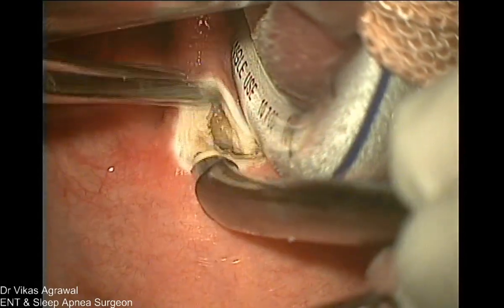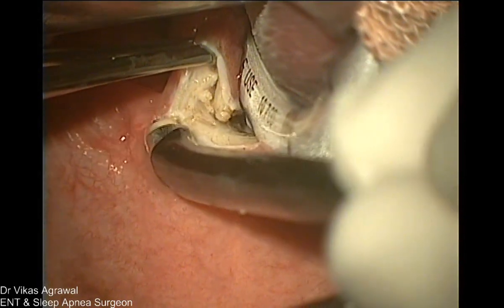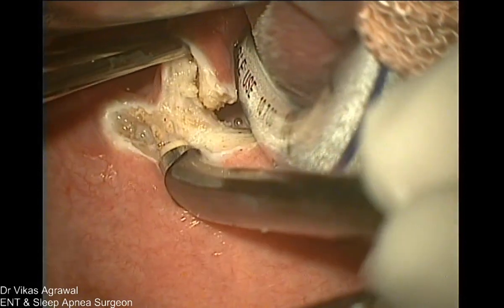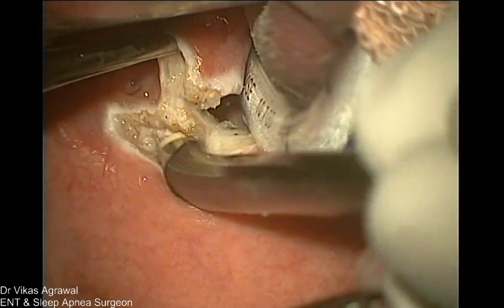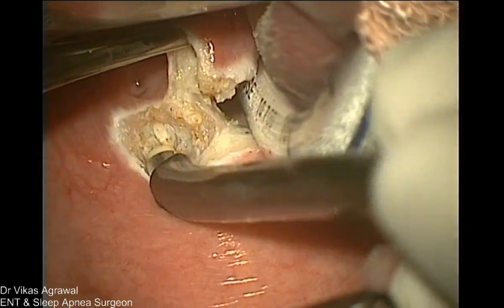Okay. So now this is the uvula and we come into the anterior pillar of the tonsil. Now there is no business removing the anterior pillar. So I'll just open up the anterior pillar to go into the supratonsillar pad of fat. Now can you see these are the fibers of the anterior pillar which we need not go into deep, and here I am into the supratonsillar pad of fat. Can you see that pad of fat? Yeah, absolutely, seen very well.